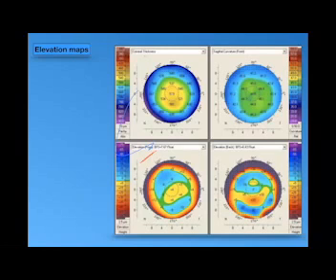If you look at this map, you will find that the anterior elevation is not present here in this map, but here there is the elevation back. Just I will show another slide with the anterior elevation. You will find that on the right side, the posterior elevation of +33.